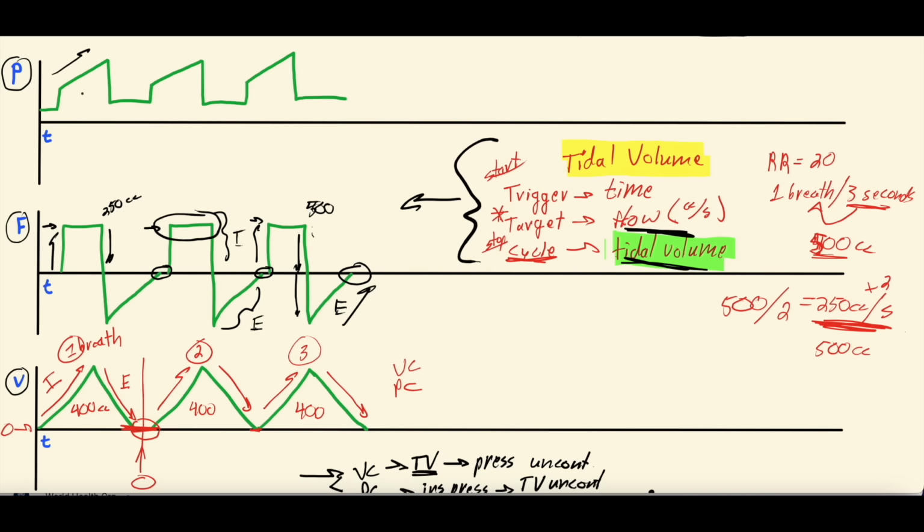And that's also why you get this ramped up pressure, because if you give a set flow rate, it's going to slowly build up the pressure in the lungs, right? You've got 2 lungs here, you've got a trachea that goes into these lungs, and I'm pushing air in, and that air has to expand the lungs.